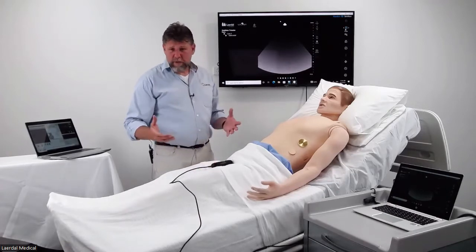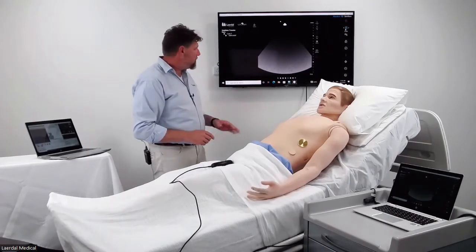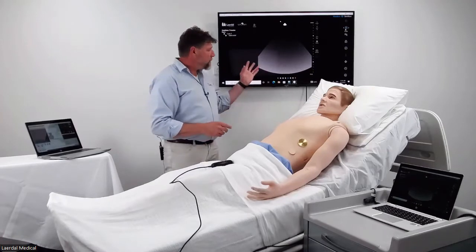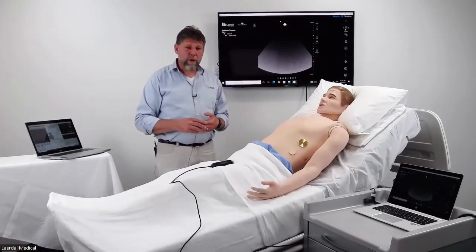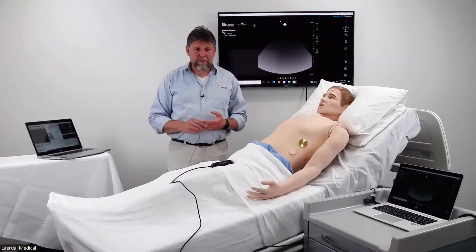And just for the purpose of this particular demonstration, we've mirrored that image onto the screen behind me. I appreciate that the image probably won't be that clear during this webinar, but when we manipulate the heart rate and respiratory rate, we'll take close-ups of the screen so you'll be able to see those.